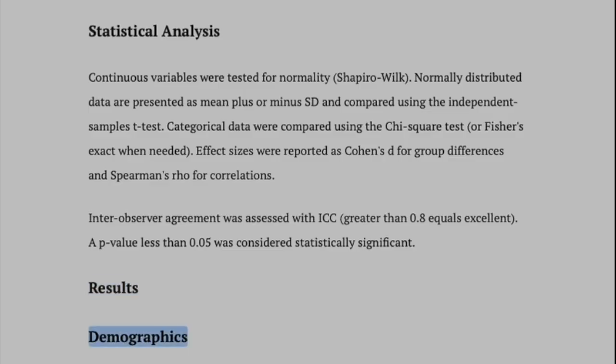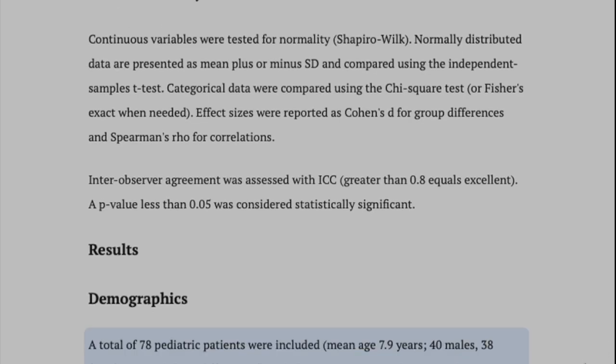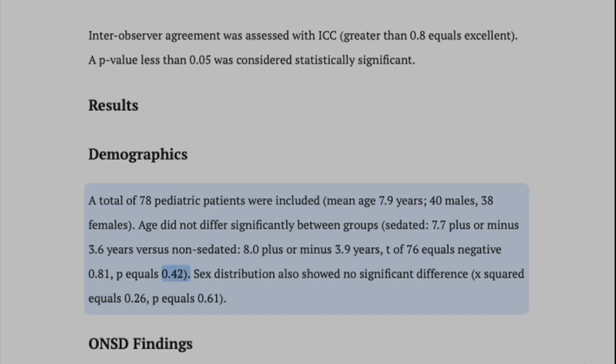Results. Demographics. A total of 78 pediatric patients were included, mean age 7.9 years, 40 males, 38 females. Age did not differ significantly between groups, sedated 7.7 plus or minus 3.6 years versus non-sedated 8 plus or minus 3.9 years, t of 76 equals negative 0.81, p equals 0.42.